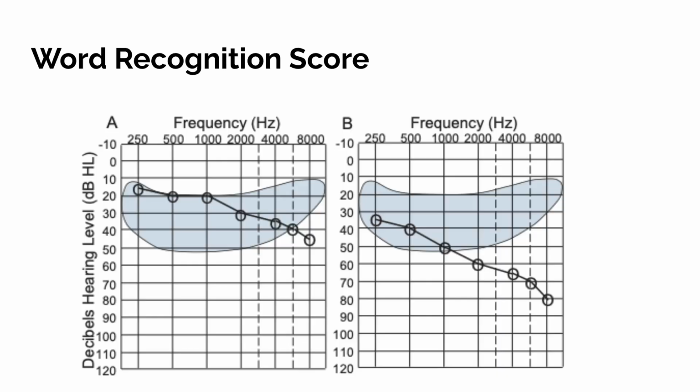This figure shows how two different hearing losses could affect the audibility of the different speech sounds presented at a relatively normal conversational level of 50 dBHL. Even with a mild high-frequency hearing loss, you can see that many of the high-frequency components of consonant sounds like F, S, TH, T, Z, V would be inaudible below the patient's thresholds and might cause some word confusion, such as in flight versus sight. Of course, different degrees and shapes of hearing loss will result in different acoustic features being audible to the patient.